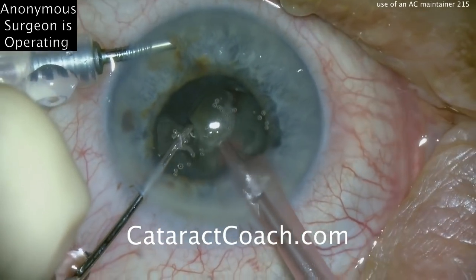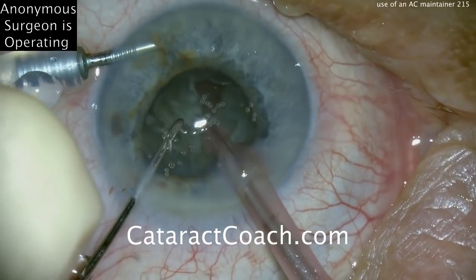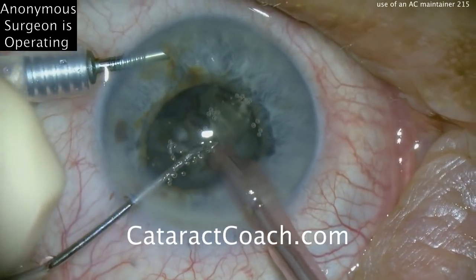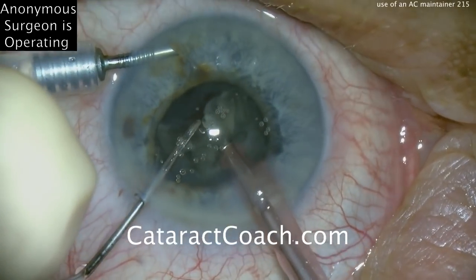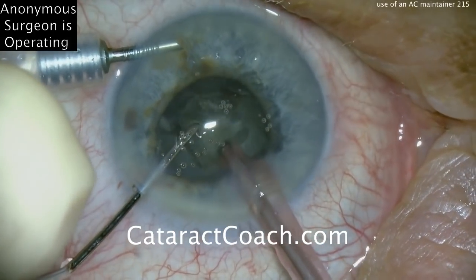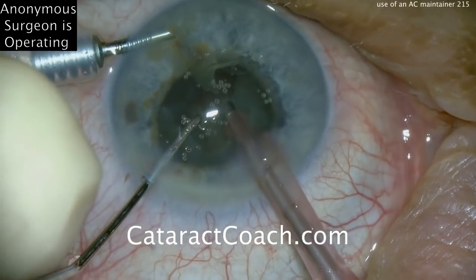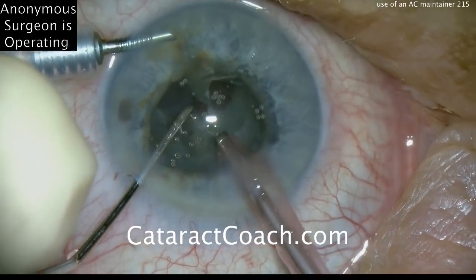This is a tough case — not an easy one. Look how small the pupil is, and the nucleus has a good amount of density as well. The challenge is certainly here, but this resident is doing a really good job. This is excellent. We definitely give this doctor a very high grade.